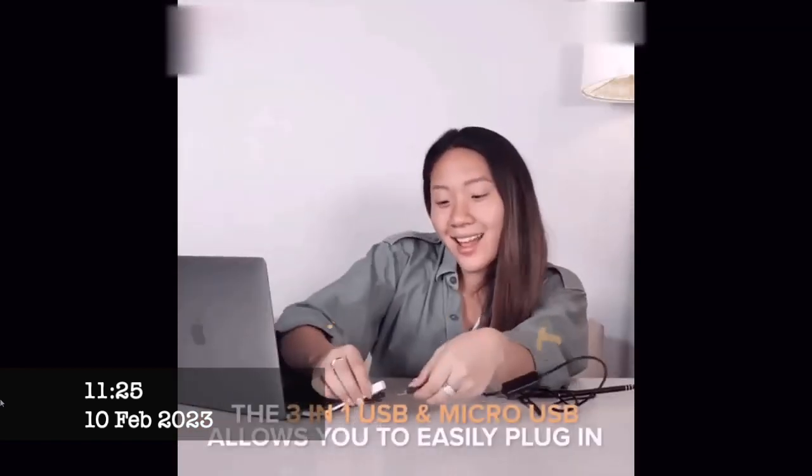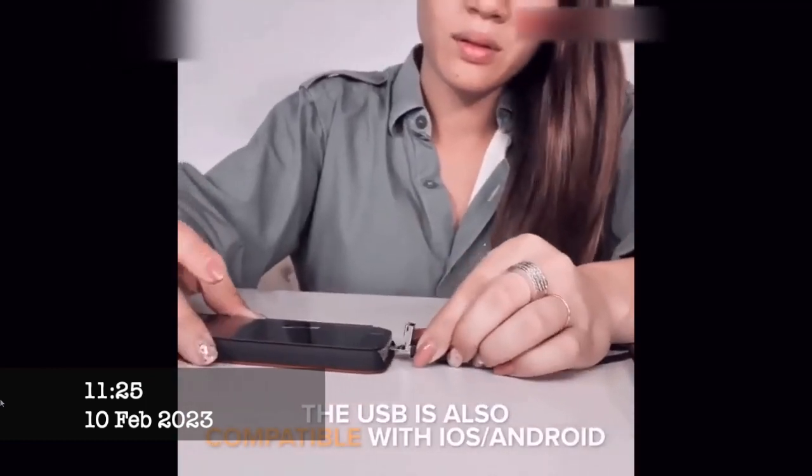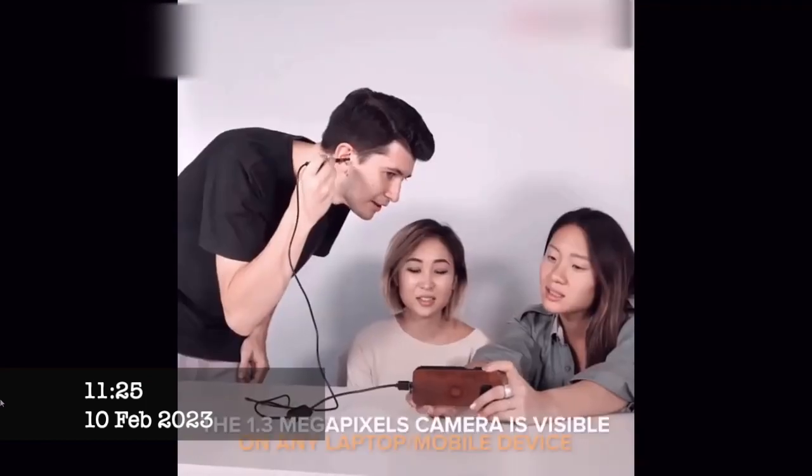This particular tool works by connecting it to your computer or smartphone, which will theoretically allow you to visualize your ear canal while safely removing the wax from your ear using the wire loop. And since these companies' advertisements clearly indicate that using the video endoscope is a fun, safe, and effective way to remove earwax, I figured I would go ahead and give it a try.